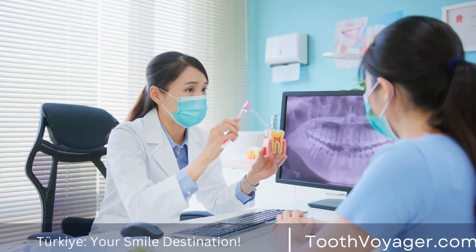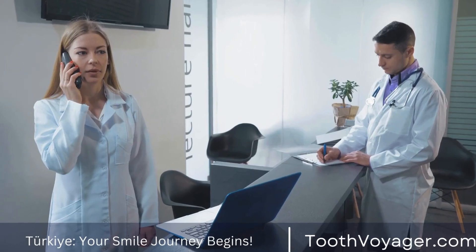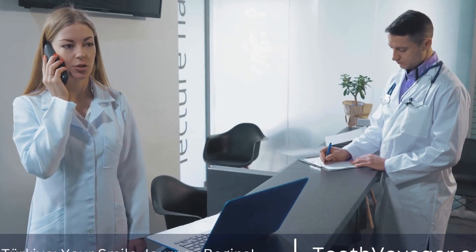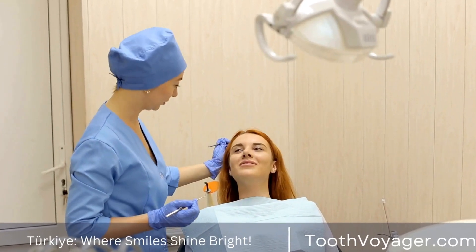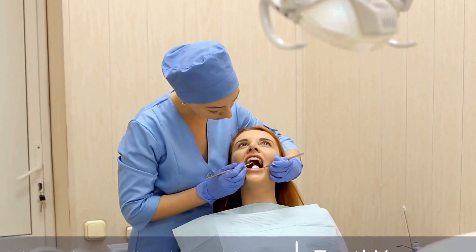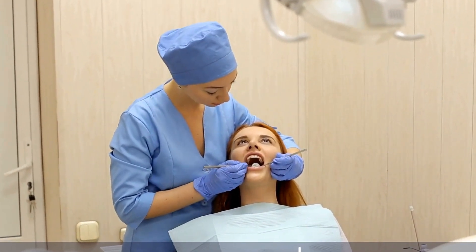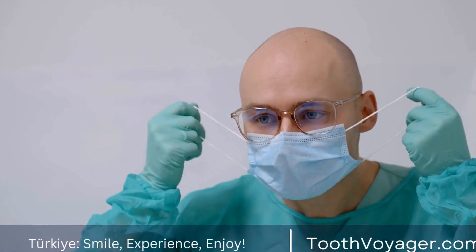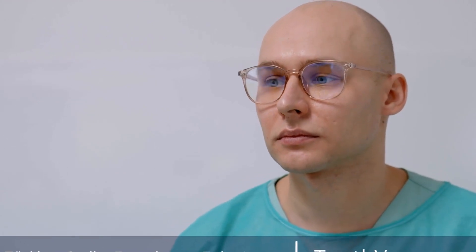What Are Dental Bridges? Dental bridges are a type of dental restoration used to replace one or more missing teeth. They consist of two crowns placed on the teeth on either side of the gap where the missing tooth or teeth used to be, and a false tooth or teeth that fills in the gap. These false teeth are known as pontics, and they can be made from a variety of materials such as porcelain, gold, or alloys.